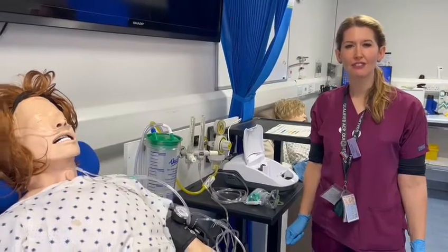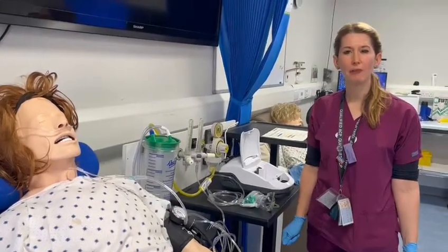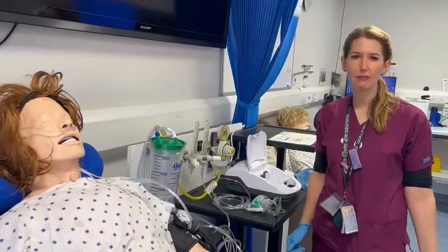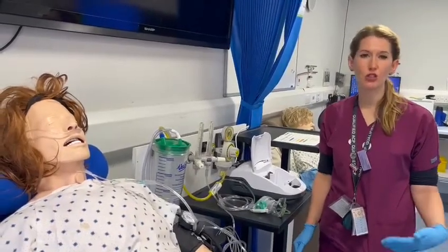Hello, my name is Kirsty Lane and this video is going to go through how to set up a nebuliser. This is often for our COPD or asthmatic patients that might be on nebulisers four times a day.